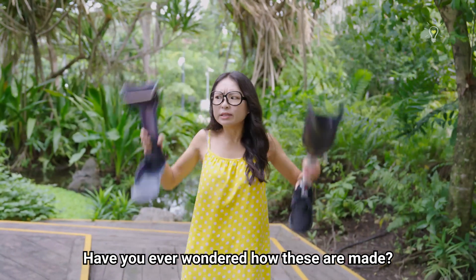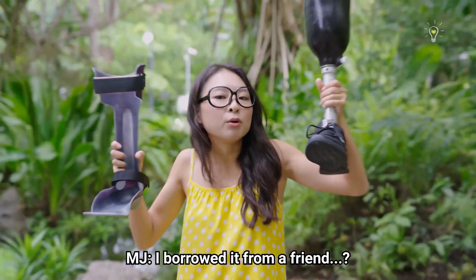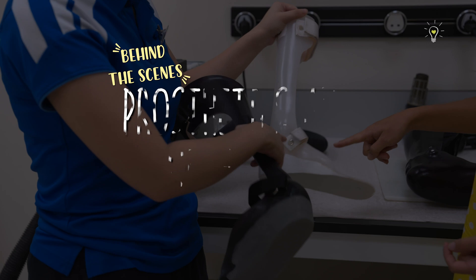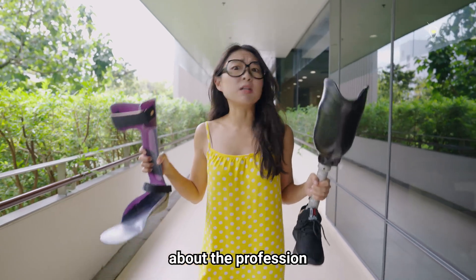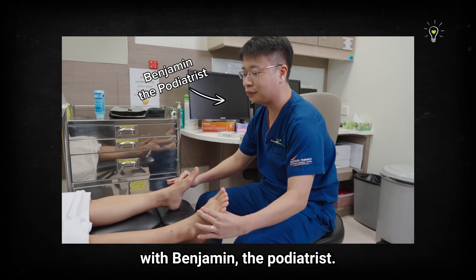Hi guys! Have you ever wondered how these are made? Where did you get those from? I borrowed it from a friend. I've been really curious about the profession of prosthetists and orthotists ever since I filmed that episode with Benjamin the podiatrist.